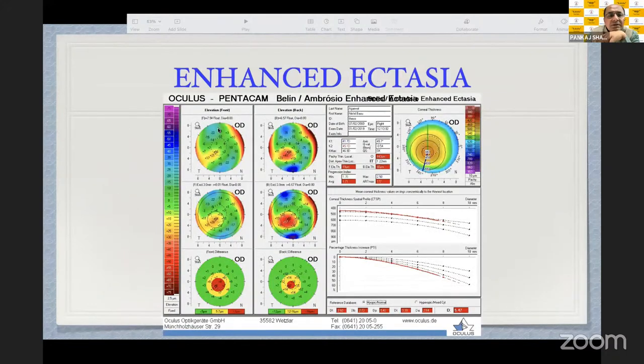How does it work? For example, this is the front. It is a 7.94 best fit sphere. It excludes the values of that 3 millimeter area. So instead of a 7.94 best fit sphere, it takes 8.01, slightly flatter. As soon as it does this, this gets enhanced. Now you can see these values, 16, 21, 17, become 34, 28, 21. But this 14 stayed 14, this 3 stayed 3, so the other values did not change as much as these did, because these values were causing a wrong best fit sphere.